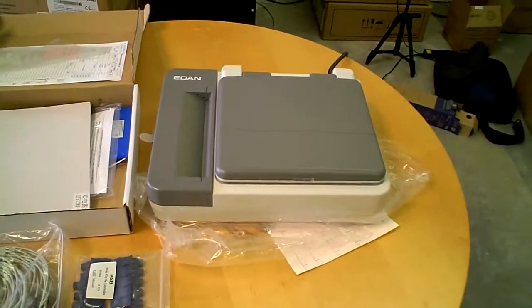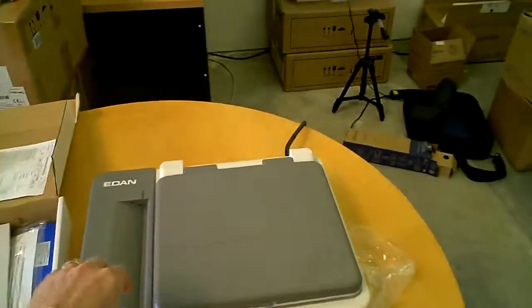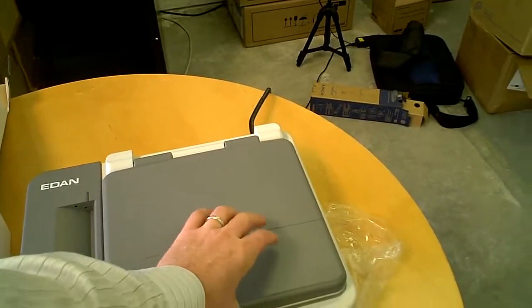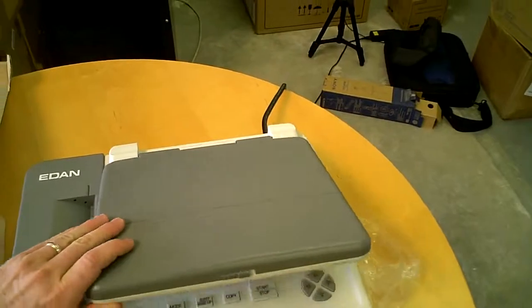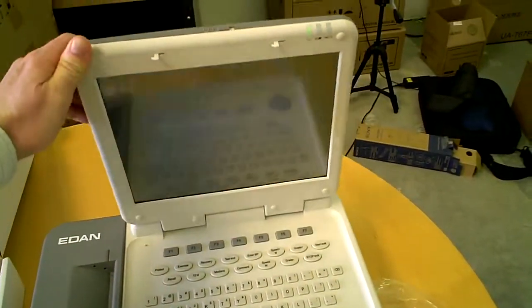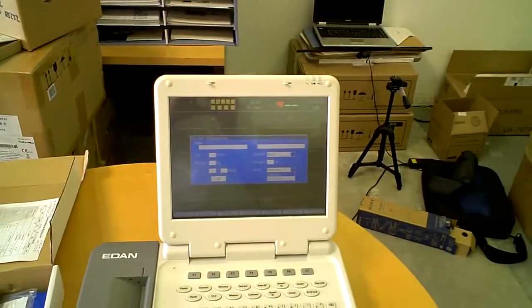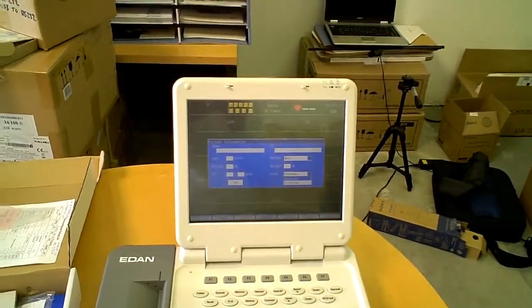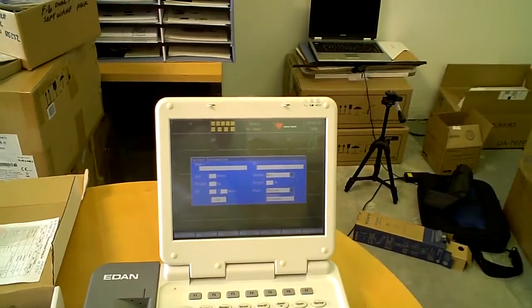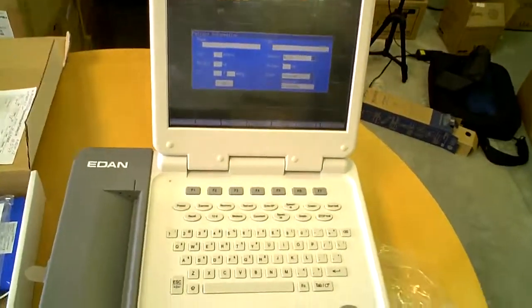Next we're going to talk about the SE12 Express with optional stress. As you can see, this machine currently is closed and it has a flip-up screen, which is a 12-inch color touch screen — very similar to the SE1200 Express, but of course this has a larger screen setup and has a stress option.